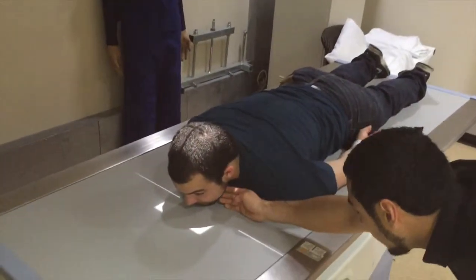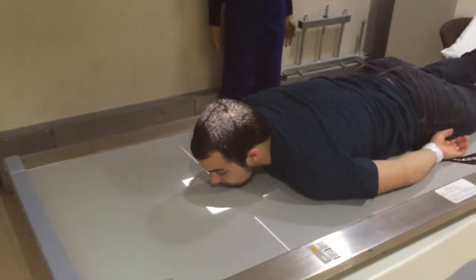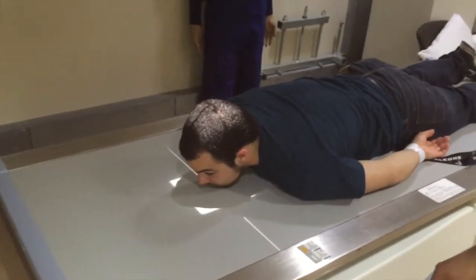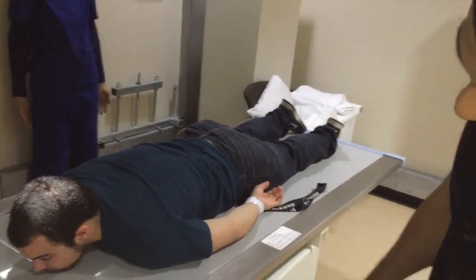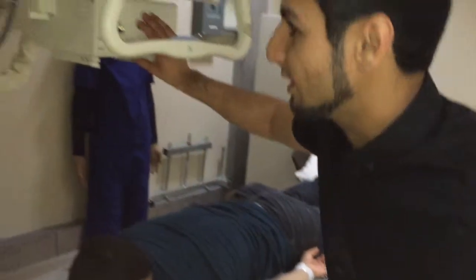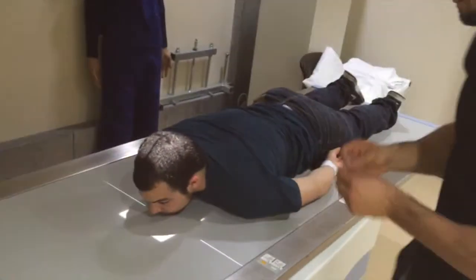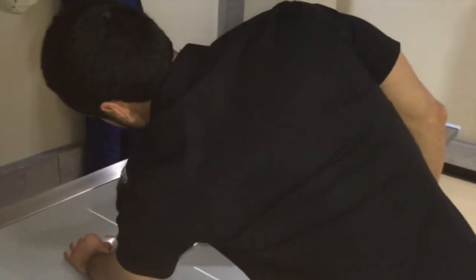The MML is perpendicular to the IR, which creates a 37-degree OML to the IR. And after you've palpated the mastoid processes and the orbital margins, we are good to go. All we have to do is place the marker on the correct side of his anatomy, which will be the right, on this side.